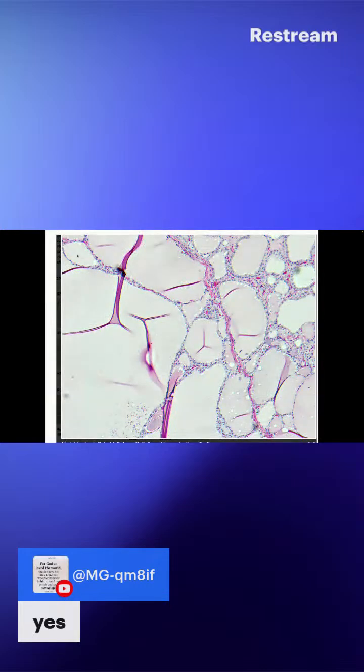Here you can see that these follicles are becoming too enlarged, which is what we call a cystic enlargement or macrofollicles. Even the follicular cells are becoming very flattened. You can see here that it's very flattened, and there are different sizes, but the striking thing is how large the follicle can be. So it can even have a follicular nodule by itself. But we don't call it that, because it's not alone and it's not partially encapsulated. We say that this is part of the same process, the same disease.